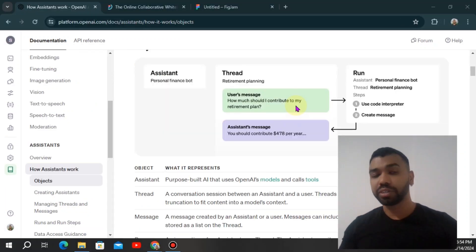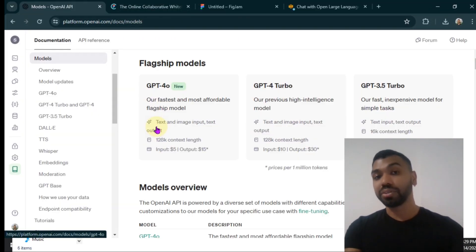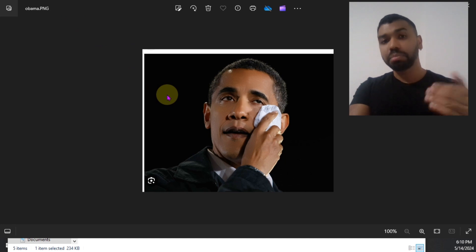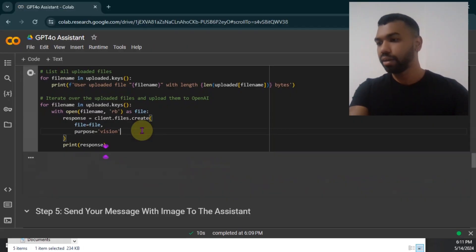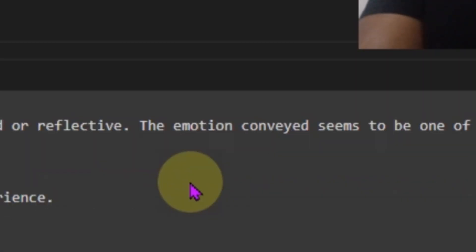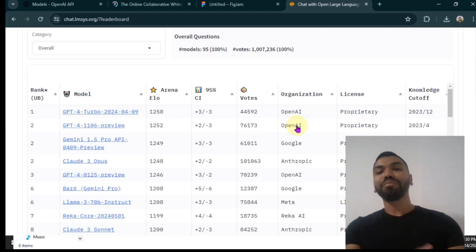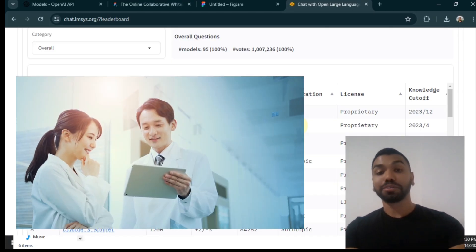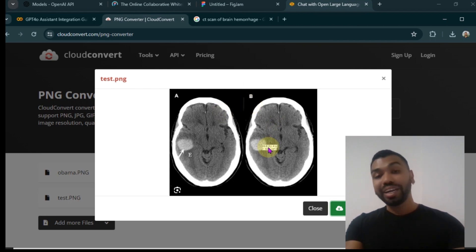In this video, we will explore how we can use the OpenAI Assistant API to leverage the multimodal capabilities by taking a text and an image as an input, and then producing the output. We're also going to gauge the quality of these responses. We're going to put Omni to the test by assigning a role to it as a medical diagnosis professional. We're going to test if it's able to detect brain hemorrhage in an image.